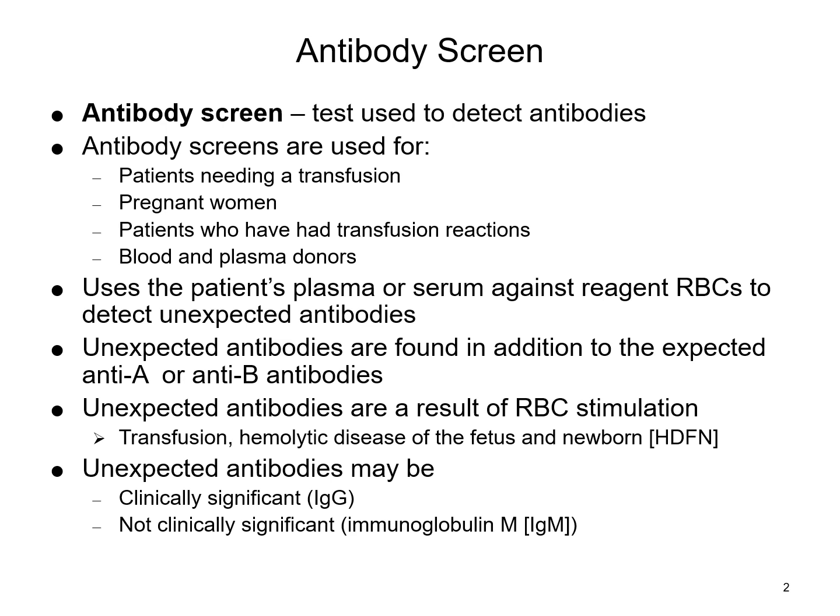Of course, IgM is considered more of a cold type reactant antibody, so it's typically not an issue in blood bank, but occasionally you can see some scenarios where it does cause some issues. But most of the antibodies that we're looking at to actually stimulate any sort of transfusion reaction response are going to be those clinically significant IgG ones.